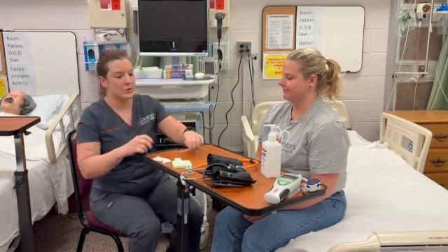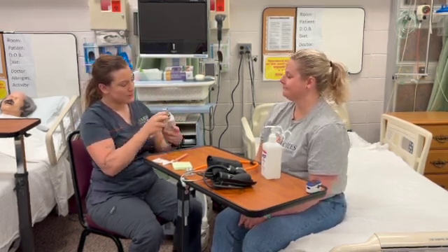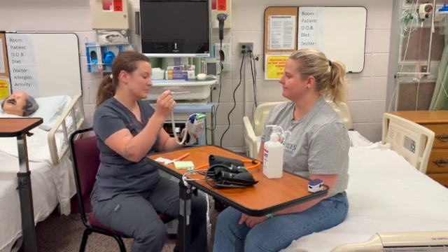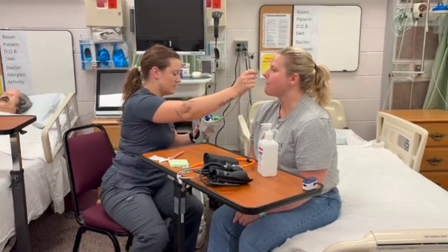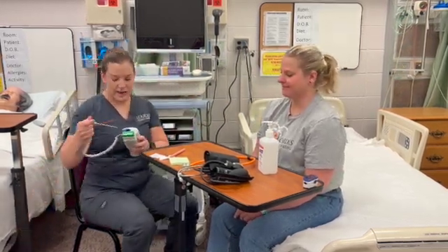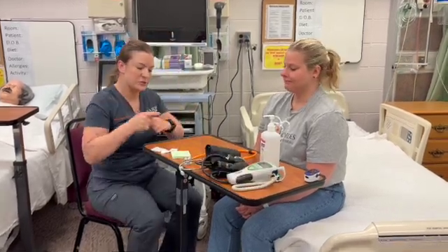And then next I'm going to take your temperature here. Go ahead and put that under your tongue. So 98.5 — and no recent fever. I did forget to ask you: within the last 30 minutes, have you had any hot or cold drinks? Have you smoked? Have you chewed any gum? No. 98.5, and that's great — within normal range.